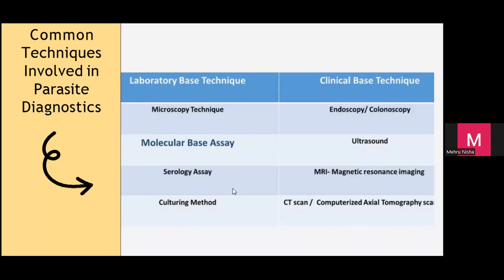Ahli yang bukan dalam field of science pun semua dah buat. Especially your ujian calitan, air liur, nasal swab. Semua ini adalah a part of serology. Example, kita ambil serology tu, dalam kit dia sudah ada dia punya antibody. Jadi bila kita ambil calitan air liur ke atau nasal swab, kita put with the buffer, then dia akan detect lah kita positive for COVID or not.